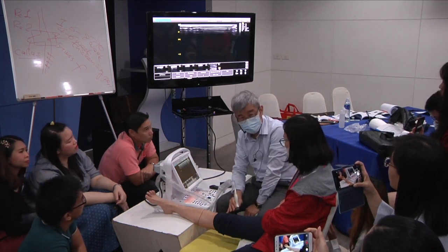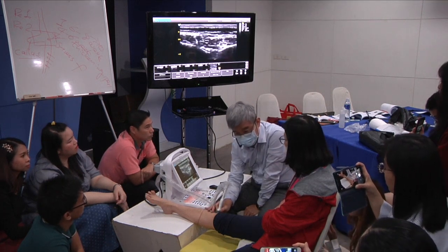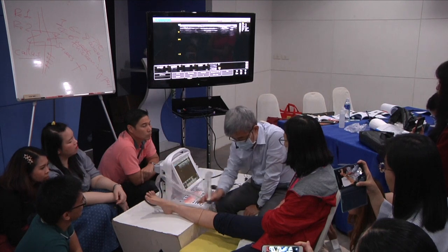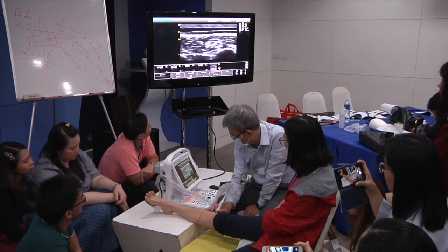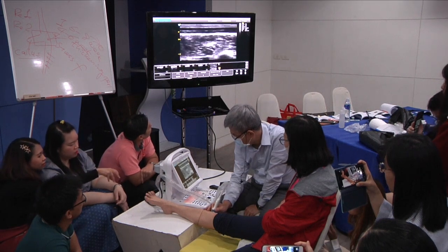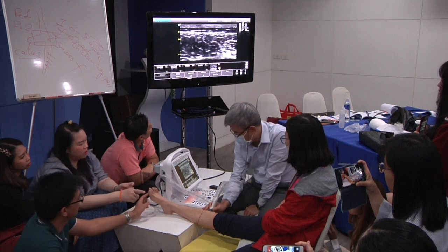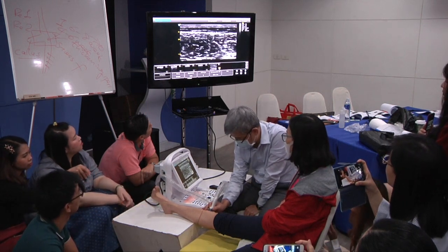Right. Exercise. 1, 2, 3. Okay, extend your big toe. Good. Say hello to extensor hallucis longus.